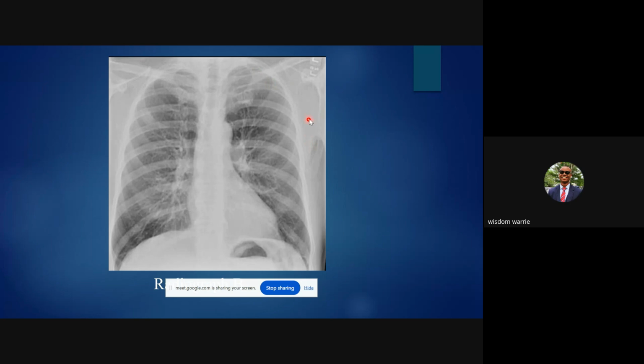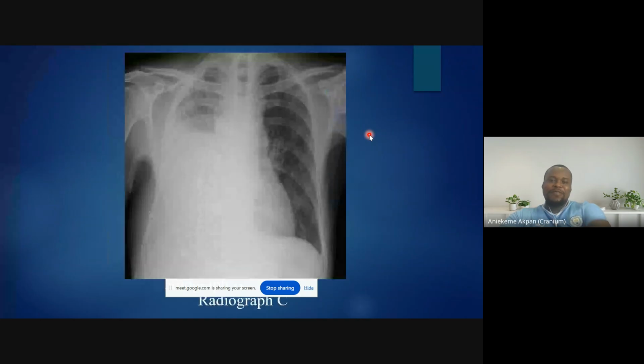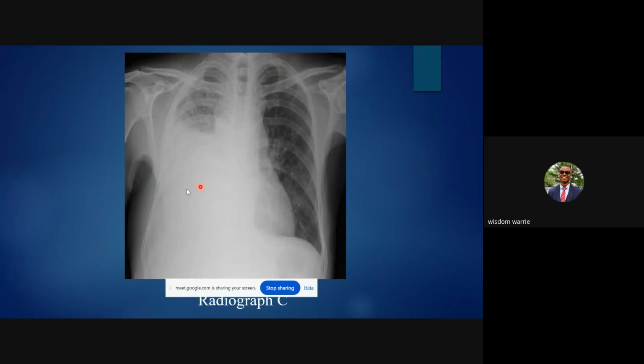Anye Kanabasi, is your hand still up? Do you want to add something to what Rejoice said? Okay, please go on. Okay, so yes, this is an interstitial pattern. That means we are all following. That means I'm a good tutor. I can appreciate myself a little. Yes, you are.